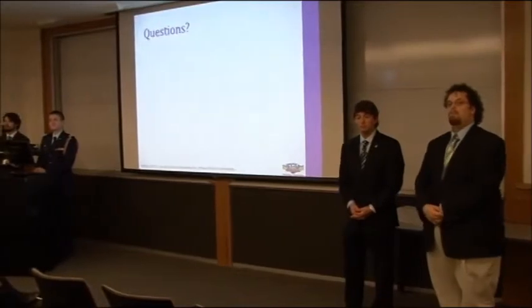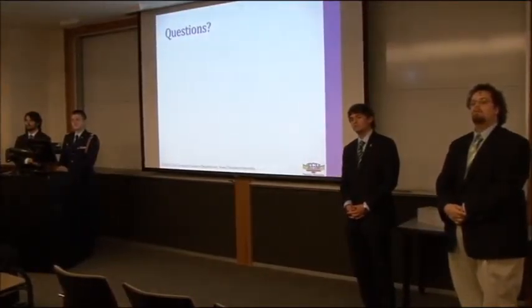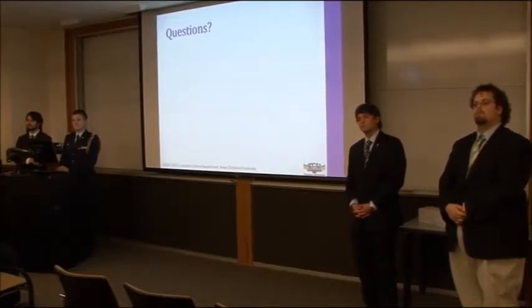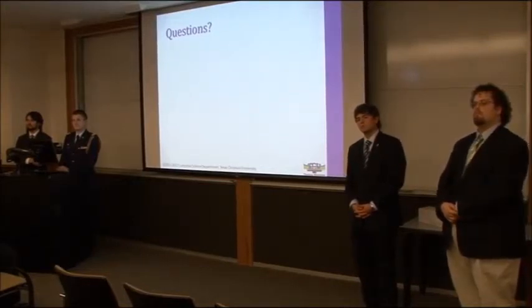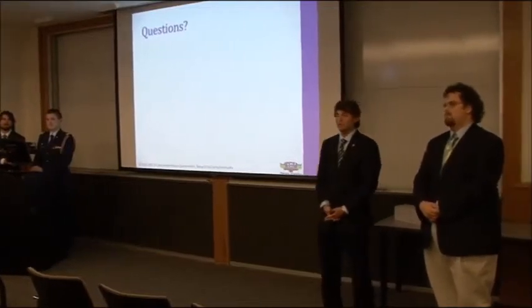How difficult would it be to do a different kind of test where you wanted to take different measurements? How much of this would you have to go back and redo? It would really depend on what kind of test it was. If it was all about tracking joints, if you could use joint tracking measures and analyze where coordinates are and do positional things, it's limitless, as long as it's not something like a finger joint, because the Kinect can't track that.